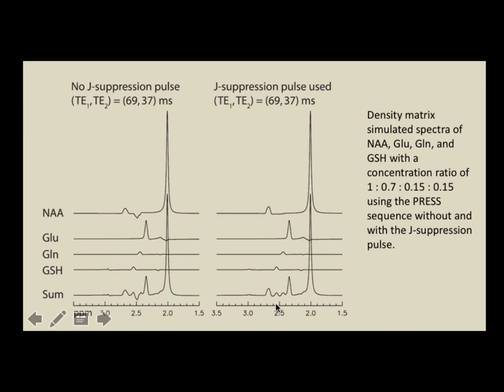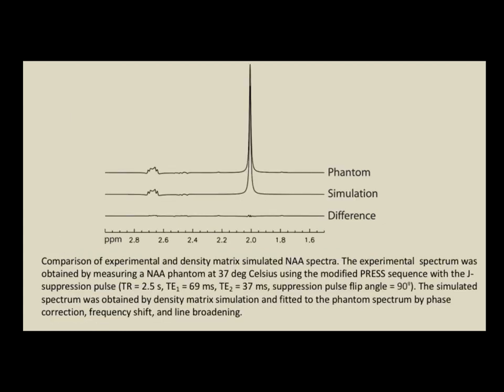So do our simulations really agree with experiments? We did a phantom experiment. This spectrum is obtained from a sphere containing NAA solution. The solution is heated to 37 degrees Celsius.